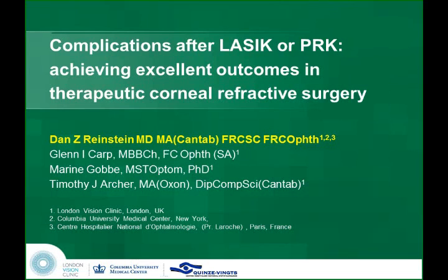Alex Stojanovic, I don't know if he's here, he was here a little bit earlier, uses the SIPTA system, and he uses a very clever way of centering everything that's nothing to do with the vertex of the cornea, which of course might be artificially changed because of the irregular ectatic surface. They use a generalized surface extrapolated from the peripheral cornea to reconstruct what the cornea was like before surgery in the first place. So it's another clever way of thinking about the geometry of the cornea.